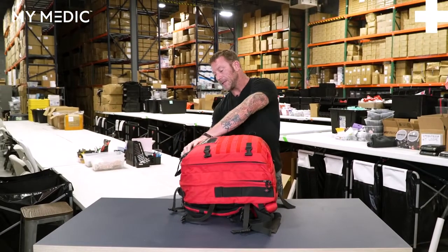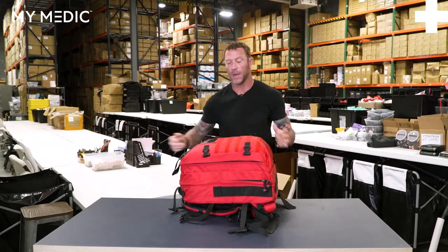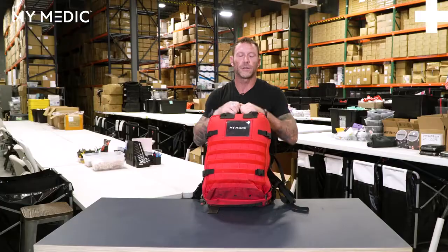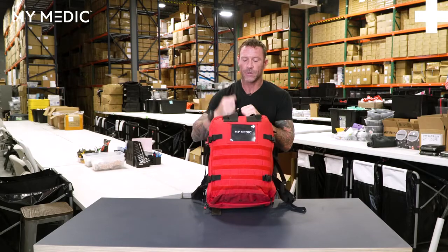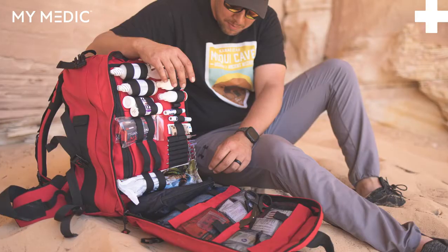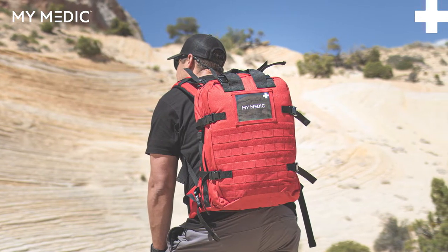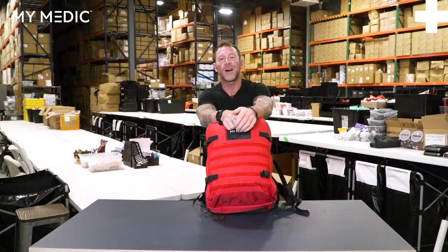All right guys, so that is The Medic — this is the big boy. This will handle a lot of patients and a lot of injuries. This is a great kit to have whether it's in an office building, your home, or whatever you need it for. If you need it, it's going to be in here. Thanks for checking this video out, guys. Stay safe, stay alive.